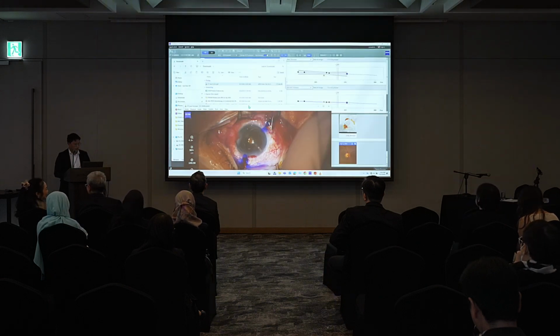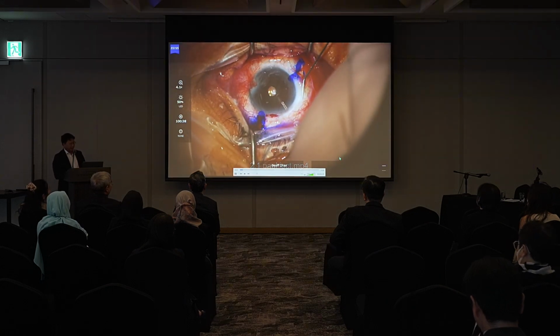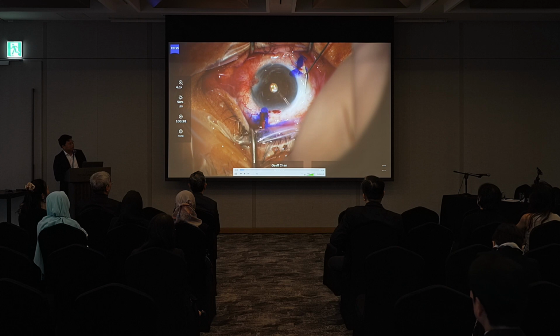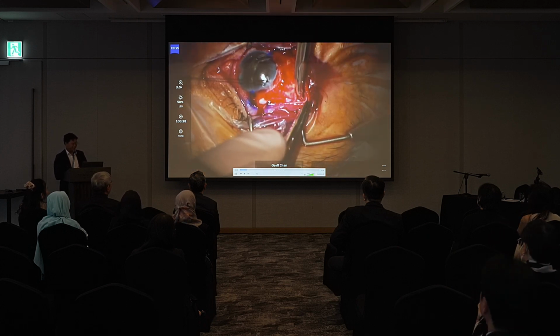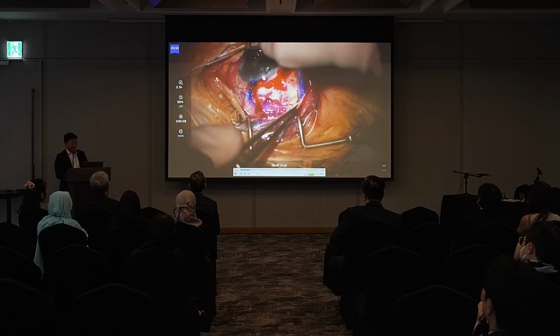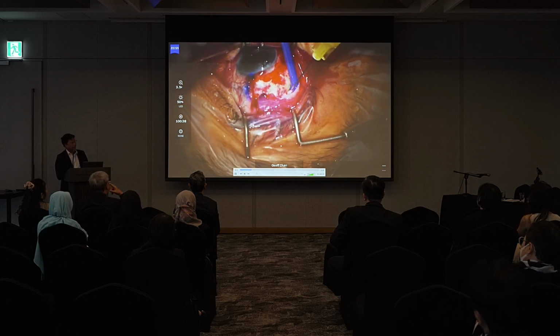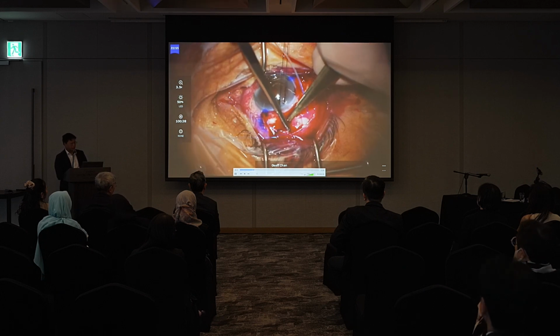So, because we all love surgical videos, right? Here's the surgery. Here's the redo, right? And I'm going, conj wasn't mobile, and it's really not mobile, right? Because I'm trying to use the lignocaine to viscodissect, and that's just nothing but tense fibrotic tissue. This is the Cambridge technique, where I like to apply mito, specifically in my redos, with a Weck-Cel sponge posteriorly.